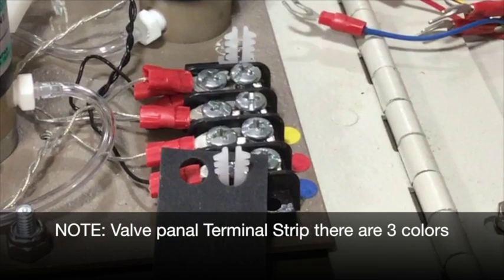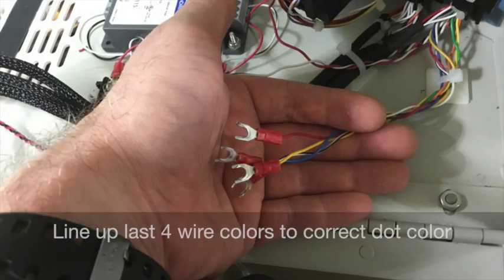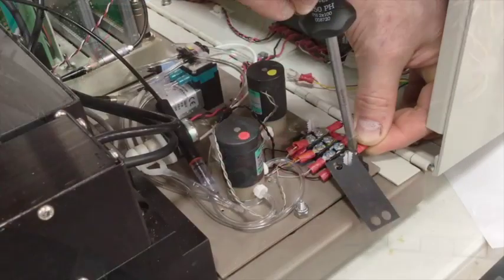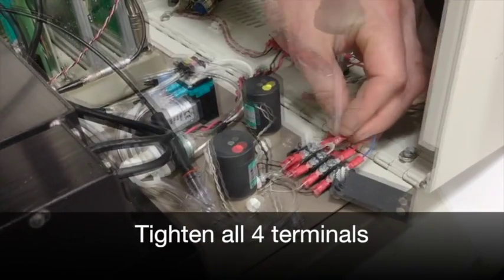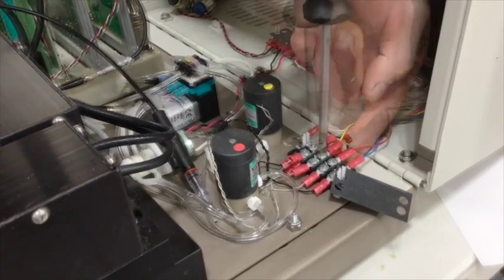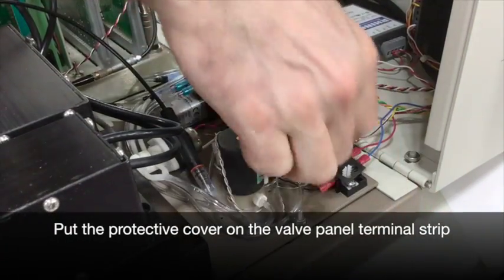Locate the valve panel terminal strip, and you'll notice that there are 3 colored dots on the valve panel terminal strip. Use the remaining 4 wires and line up the colors according to each dot, and then screw down all 4 terminals. Replace the protective cover over the terminal strip.